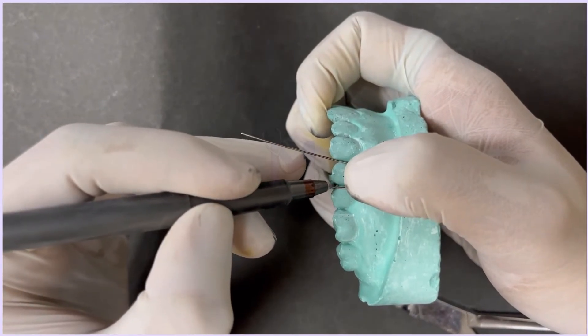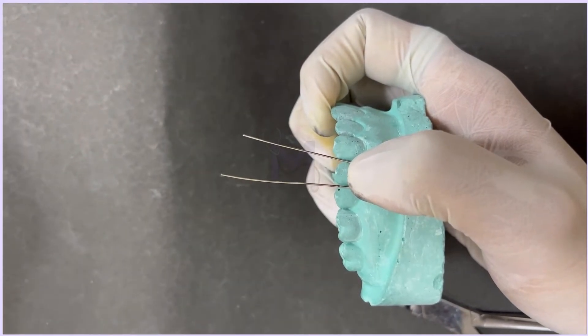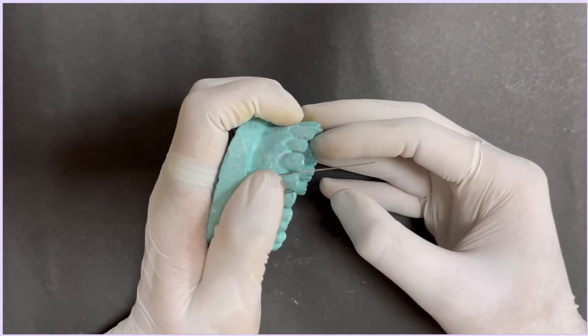After this, mark the points in the wire corresponding to the occlusal surface. Now, adapt one of the sides of the wire over the distal side to lie flat on the occlusal surface.